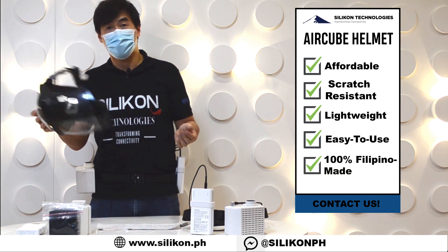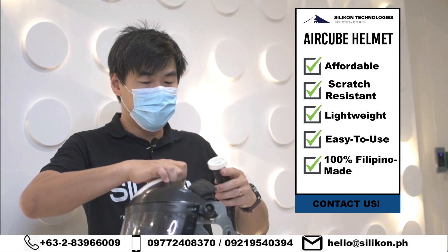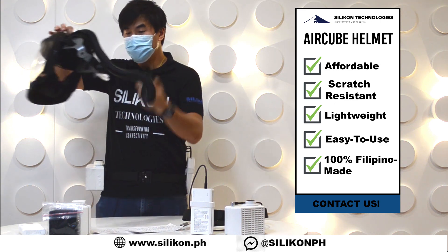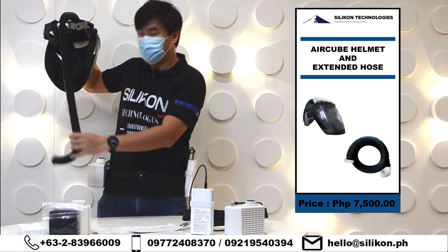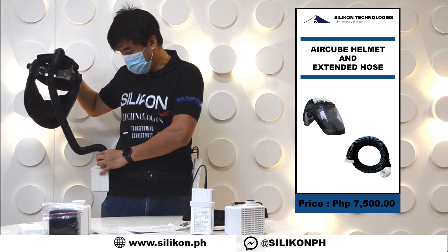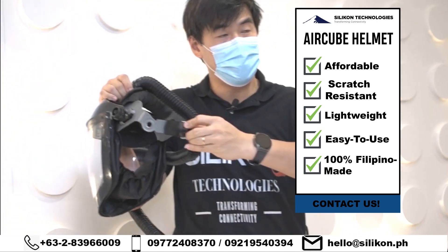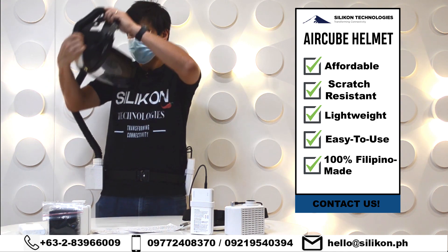How does it work? It's similar to the hood — you're still going to use your flexible hose. There's a connector here; you connect the hose to the top part of the helmet. There's also a hook here so you connect the hose to the hook, and the other part you connect to your Air Cube. Once you connect it, you just wear it and sit. There's also an adjustable head harness with a knob you turn clockwise or counter-clockwise to loosen or tighten.